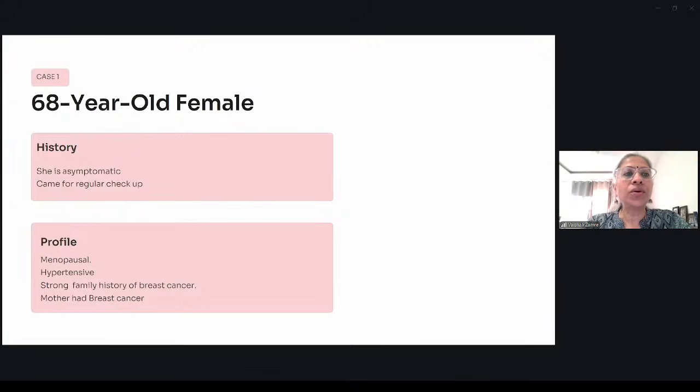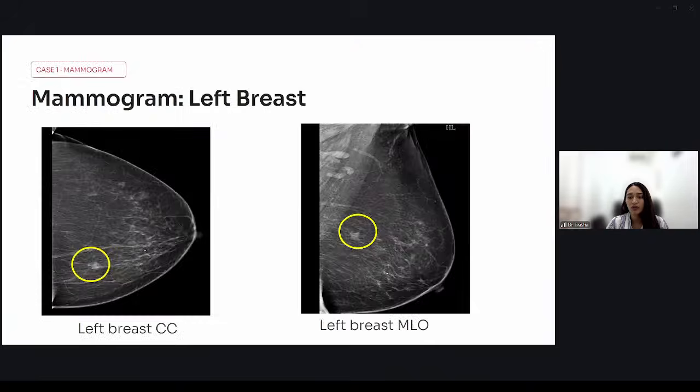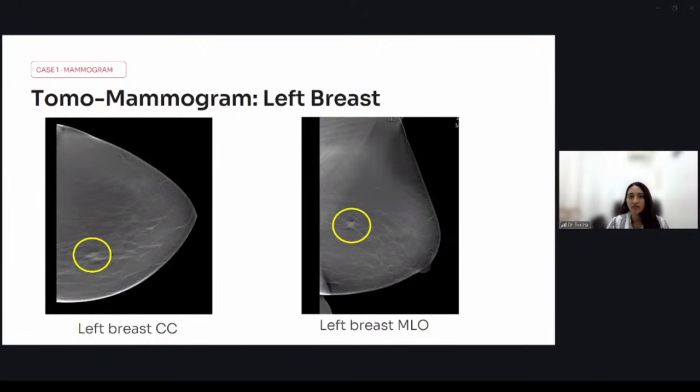Okay. Is it important to compare? That is what we would like to understand. Yes, ma'am, it is important. If she had a previous mammogram, it would be important to notice any interval changes, like a previous asymmetry or calcification of sorts, or something that she might have from probably a previous old fibroadenoma. Definitely, there will be a difference in the type of findings that we see on a mammogram. But if she has been having a certain finding for a period of time, then we can still do a follow up.